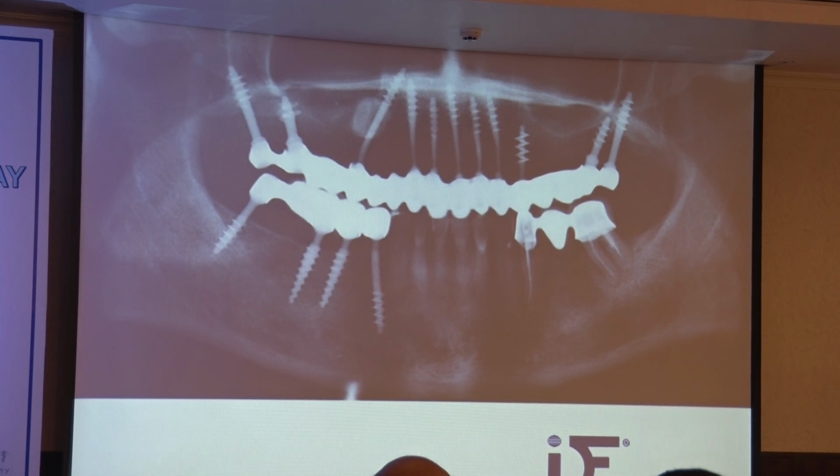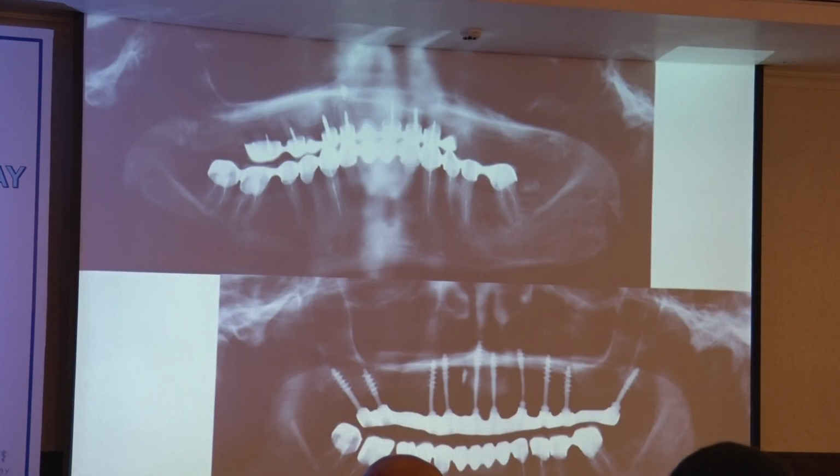It's another typical case. You see a segment in the lower jaw. We give to the patient teeth from 6 to 6 on both sides for equal mastication. So there must be the same amount of teeth, the same length of the teeth, and the same width.